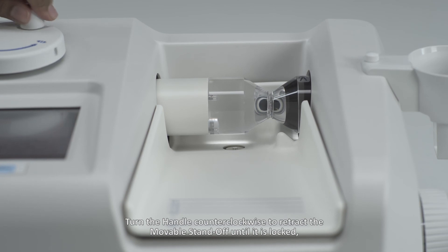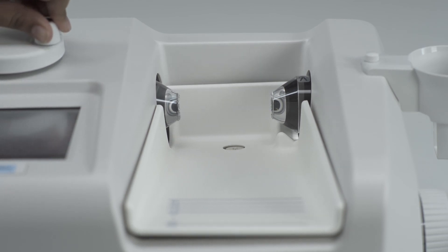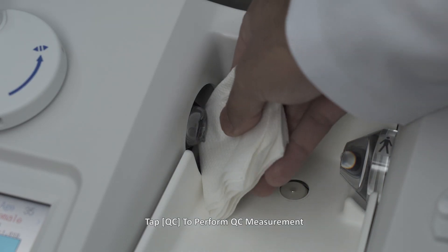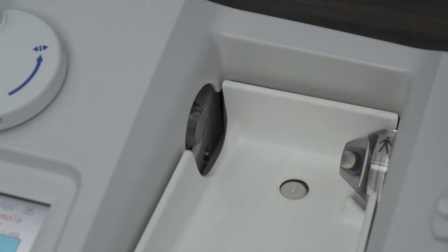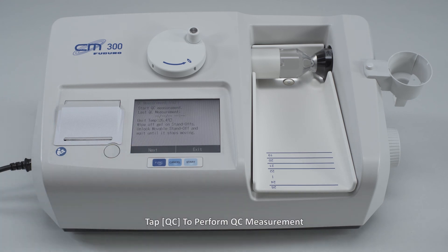Turn the handle counter-clockwise to retract the movable standoff until it is locked and wipe off the acoustic gel on the standoffs. Tap QC to perform QC measurement.